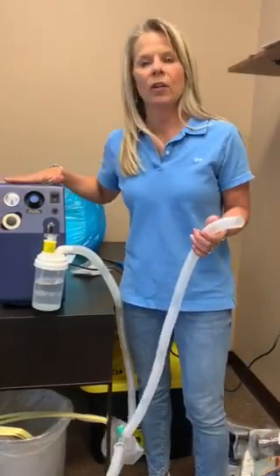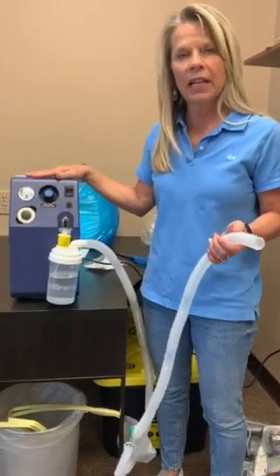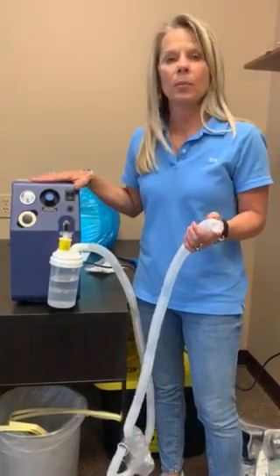Today we're going to go over an air compressor, which we use with trach patients. This is what gives them the humidification. Since they're going to bypass their natural ability to humidify the air, they usually use an air compressor.